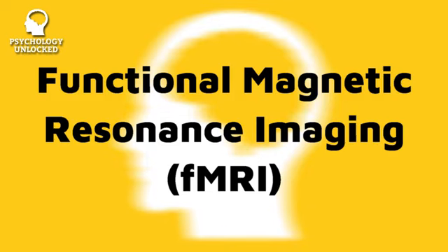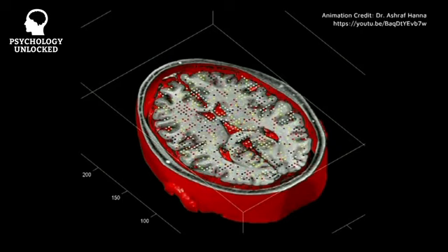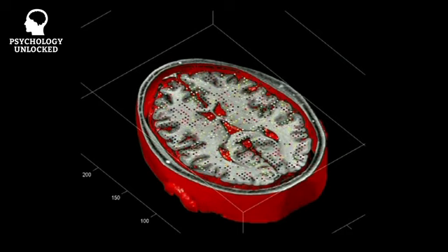And magnetic resonance imaging can be used for more than just structural snapshots too. If you've ever seen the little F snuck in front of MRI and wondered what the difference is, then listen up. That F stands for functional magnetic resonance imaging. Same technique as before, except this time multiple scans are taken as a patient is tasked with completing an action. By taking multiple scans, neuroscientists are able to watch which areas of the brain are activated in fulfilling the function under examination, in addition to seeing the overall structure of the brain.